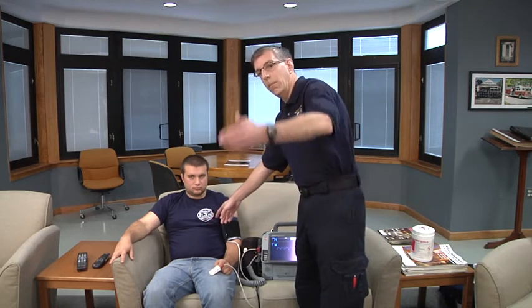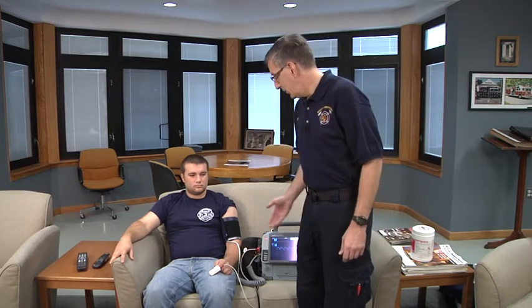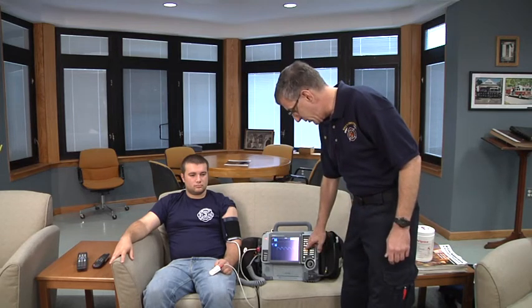If the patient had his arm above mid-heart level, you would get an excessively low blood pressure. If it was below heart level — as if he was laying on his side in the street and you chose the arm that was under the patient — you would get a higher blood pressure than is actually in the patient. So with the arm at mid-heart level, we're going to push the blood pressure activation switch on the monitor.